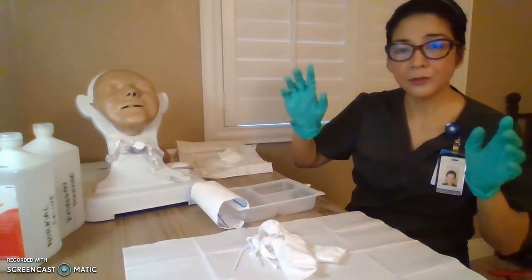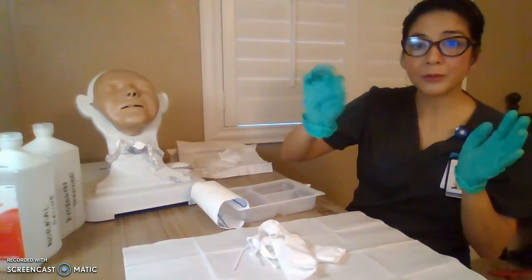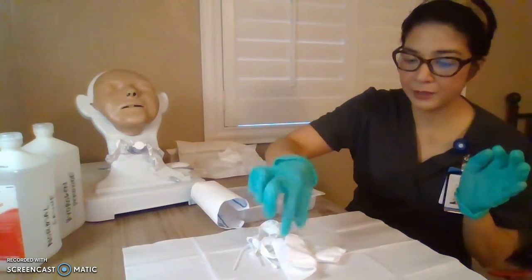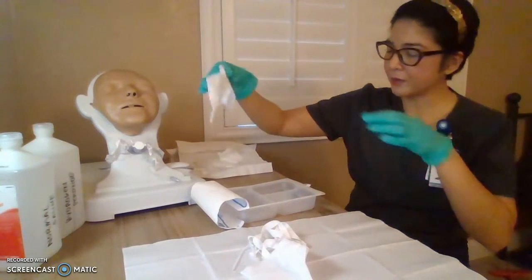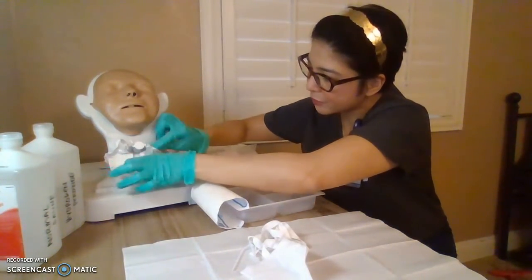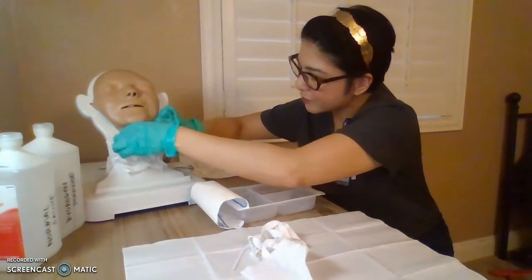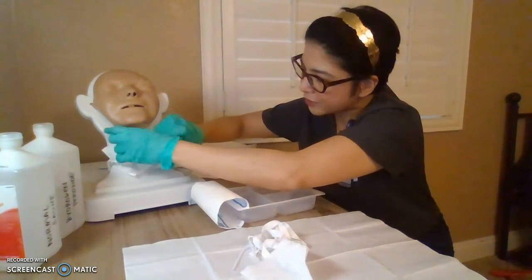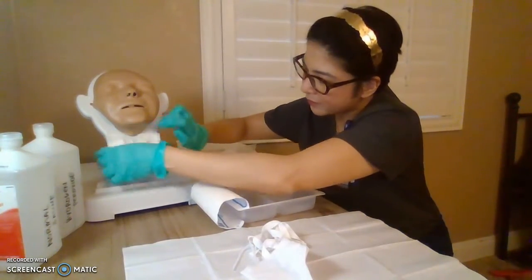Okay, now last but not least, we're now going to replace your dressing. Okay, we're going to put a clean one, a sterile one. So I'm just going to put a new dressing on your stoma. Mr. Smith, how are we doing? You're okay? How's his breathing? Check his oxygenation. Remember your numbers because you're going to have to document that later on.